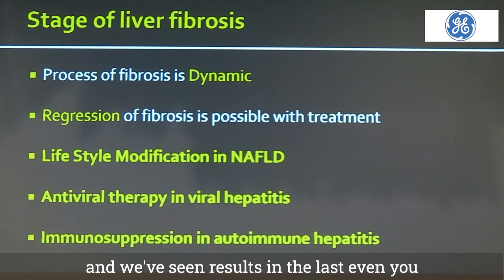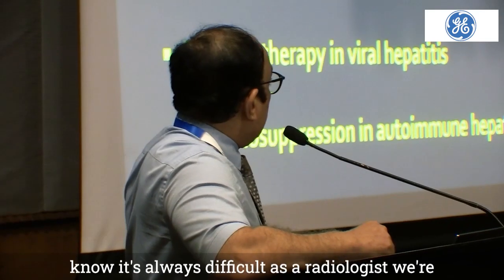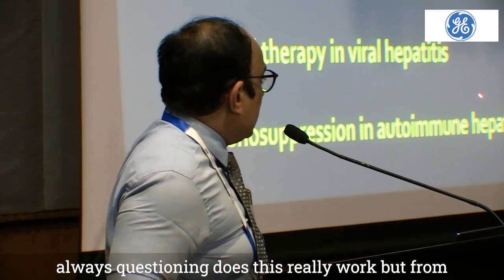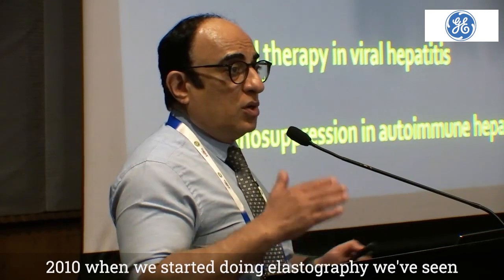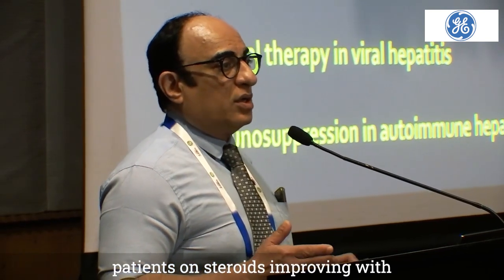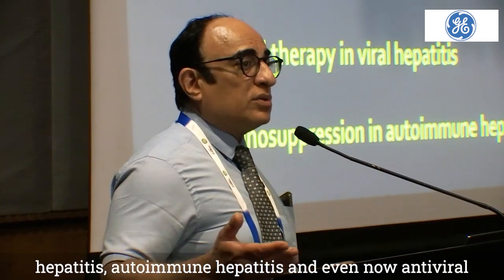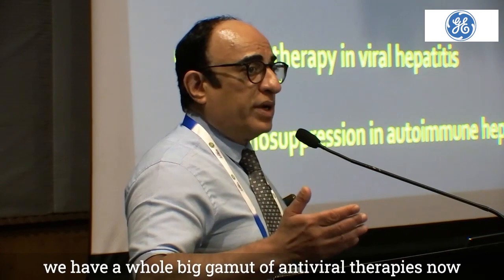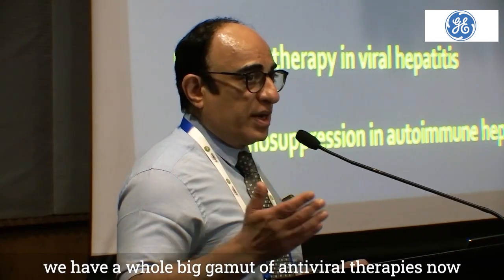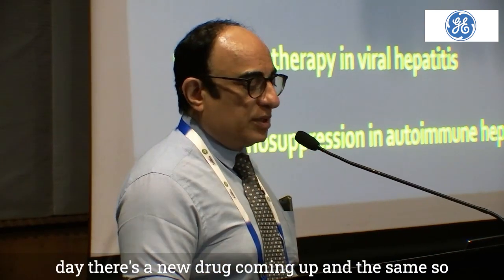And it's always difficult as a radiologist, we're always questioning, does this really work? But since 2010, when we started doing elastography, we've seen patients on steroids improving with autoimmune hepatitis, and even now patients on antiviral therapy improving. We have a whole big gamut of antiviral therapies now available. You can see in the COVID times, every day there's a new drug coming up.